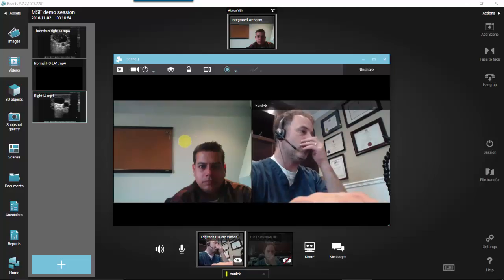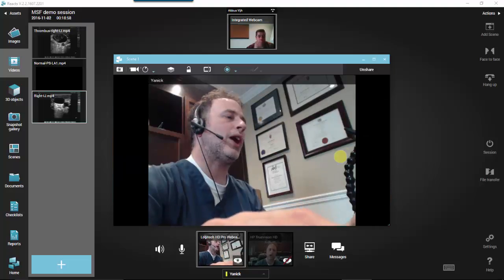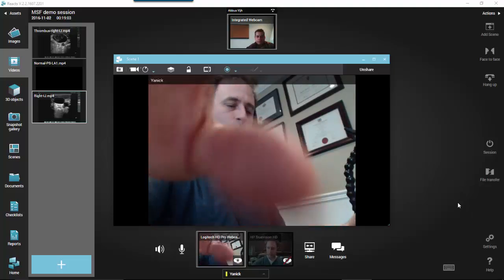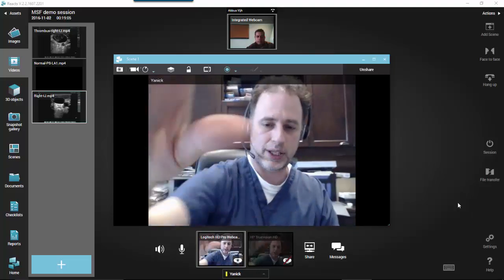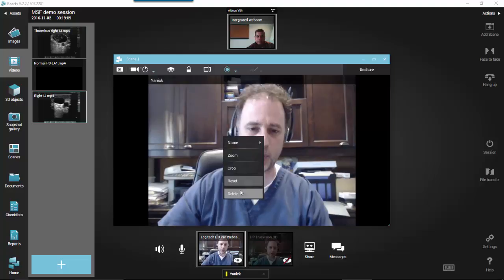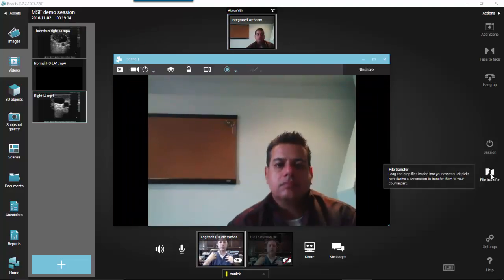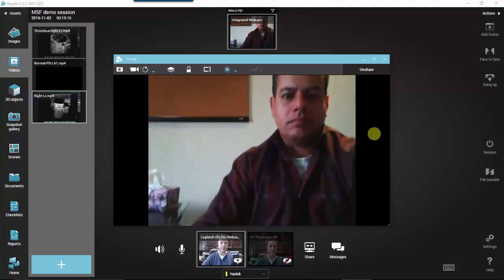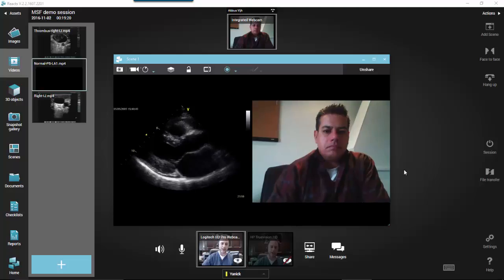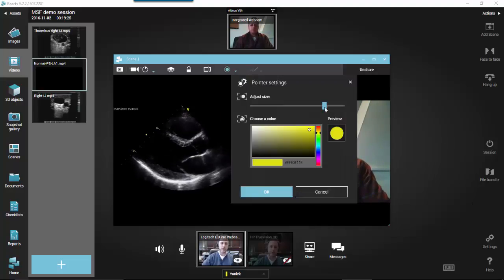Now, if we want to get into a bit more fancy stuff, let's say I want to show you how to perform an ultrasound of the heart and look at the parasternal long axis view. So I'm going to put back my camera here. In fact, I'm going to take Al as the model here. I'm going to drag and drop his feed here. So Al, just center your camera so I can see more of your chest. Perfect. Now I would take this parasternal long axis view of the heart and put it right beside here. Let me put my pointer a little smaller here.